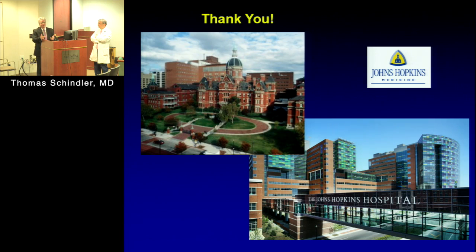And currently, if I was in the clinic, I had a PET-MR, I would do it for viability studies, because you would get the high accuracy with the viability with the PET. But you could measure with T1 non-contrast sequences the extracellular space. So some patients who have dilated left ventricle and have enhanced fibrosis around the myocytes.